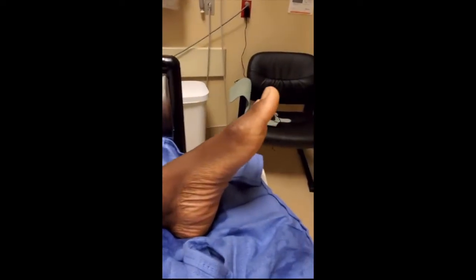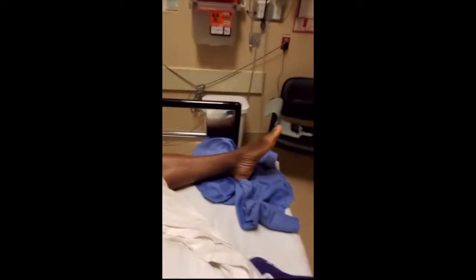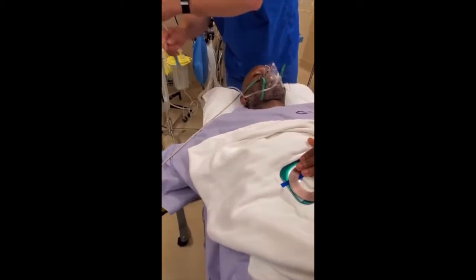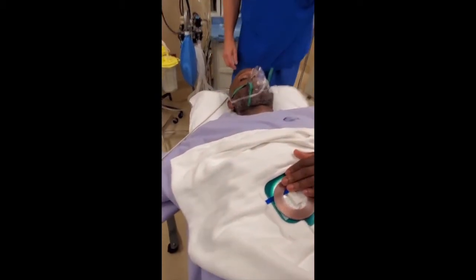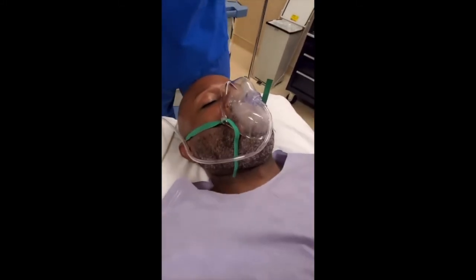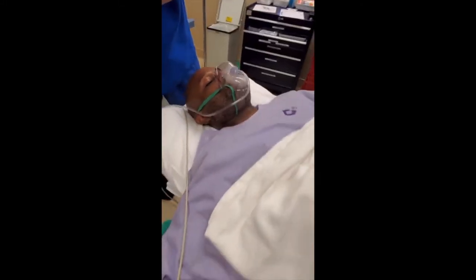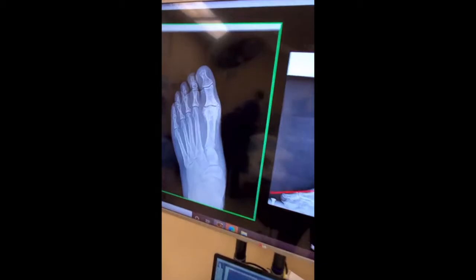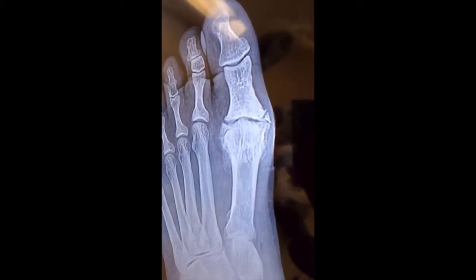He was looking for a unicorn and he found it. Let's put the medication in. Gerard's a little sleepy — it's kicking in. In less than 30 seconds we'll be ready to numb up that foot. See how the arthritis is really all over that place.